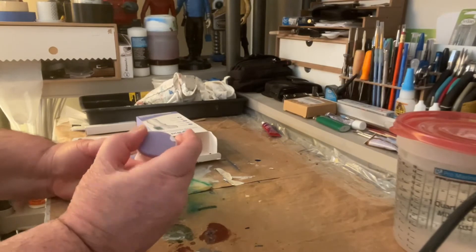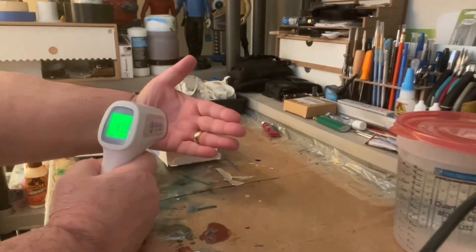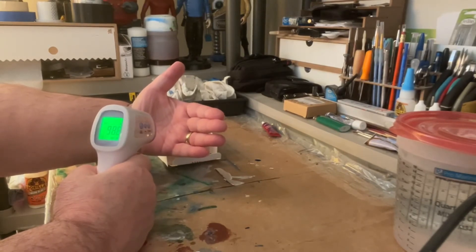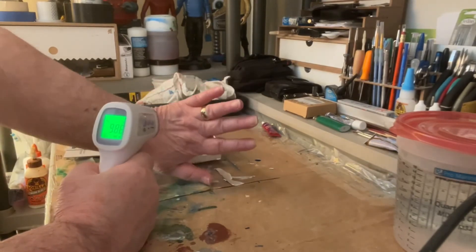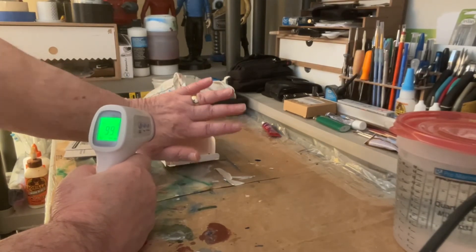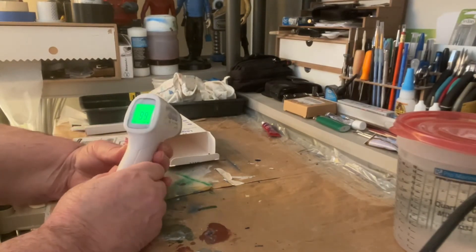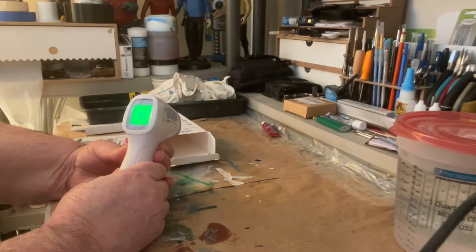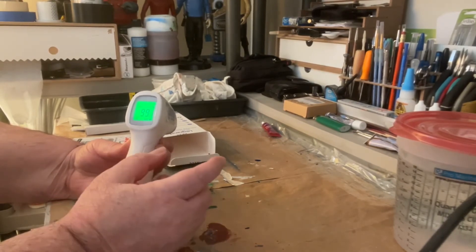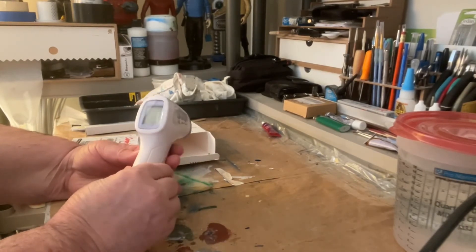Let's measure my hand — 98.6. Let's do this side of the hand: 99 on the top part of the hand. Pretty good. I have this for taking temperatures every day. I have the other old type of thermometer which you put in your mouth, but this is the way to go.